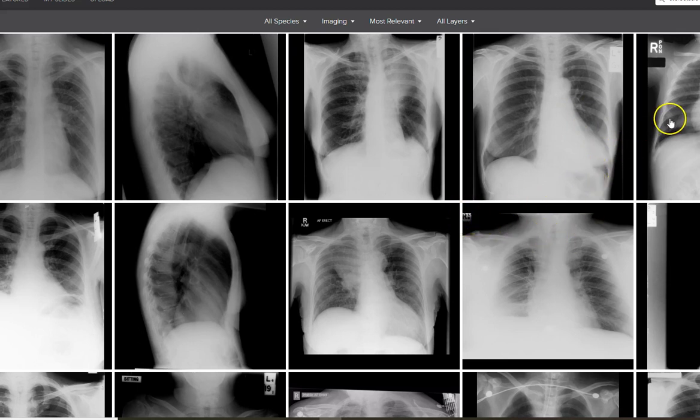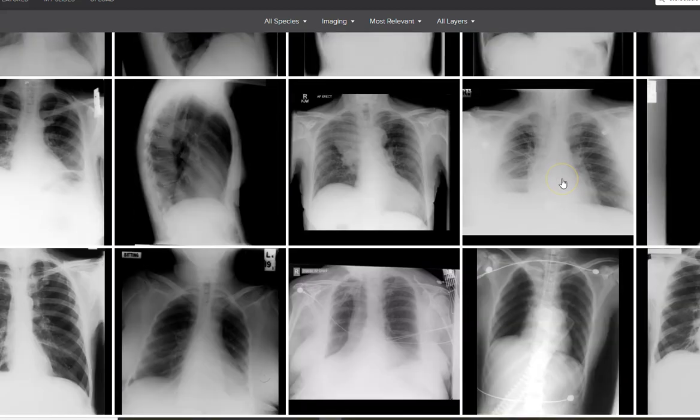And that's why sometimes, you know, X-rays are a three-dimensional thing that's been squashed into two dimensions, and I've also found that they might lag a little bit behind the clinical picture. Sometimes things don't show up on X-ray that you've almost seen in the signs and symptoms and the rest of their clinical picture beforehand. So I always back up what I'm thinking that an X-ray shows me with auscultation and with the rest of the clinical picture. It's just one imperfect tool in our armoury, but it can be really useful.